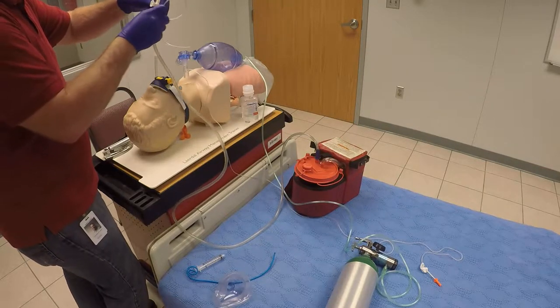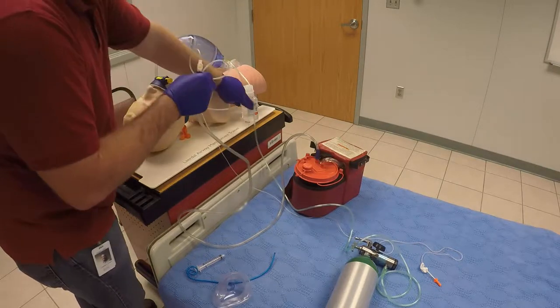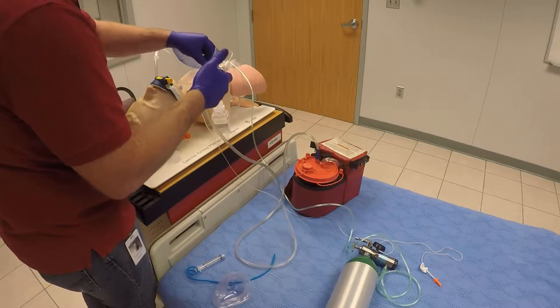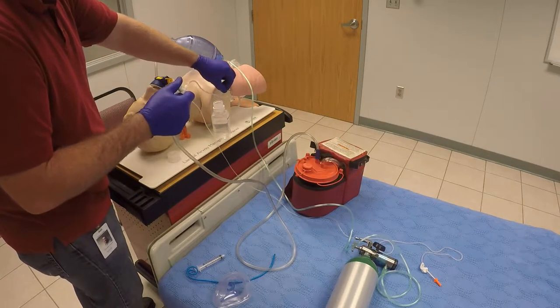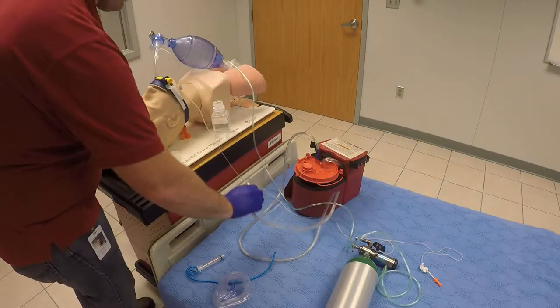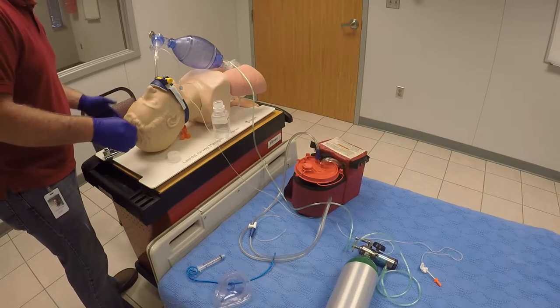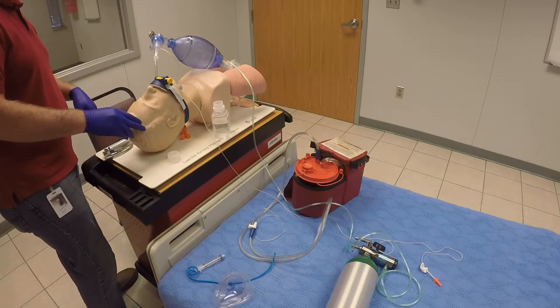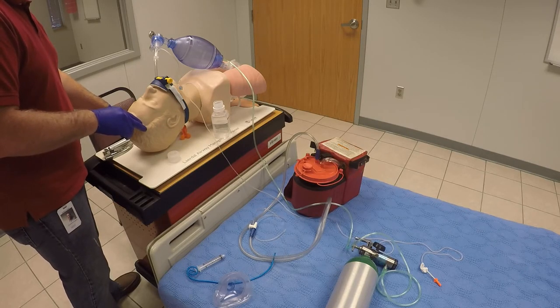As soon as you're done suctioning, have your partner begin oxygenating the patient. Flush out the suction catheter with sterile water so you can reuse it if necessary. Once you've done that, double check your lung sounds and your SPO2 readings to make sure nothing has changed or shifted. Continue monitoring your patient to make sure there are no signs of hypoxia or any adverse reactions.